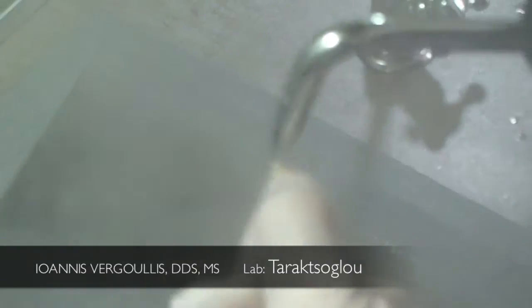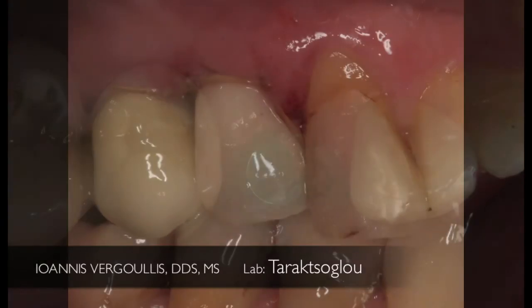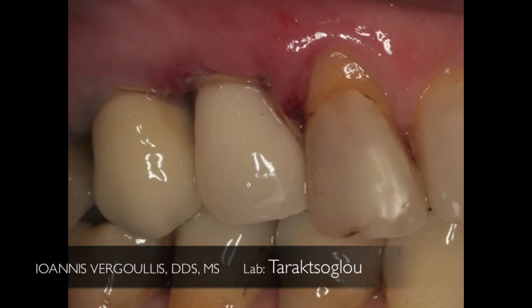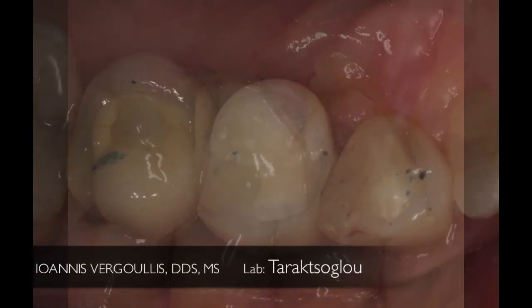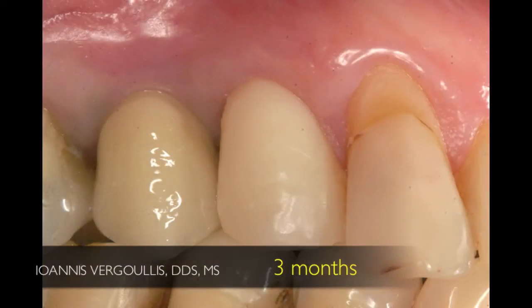The temporary crown is decontaminated utilizing a steamer and then placed into position and screwed at 30 newton centimeters. We evaluate the occlusion and make sure we don't have any contacts during lateral excursions. As you can see, three months later we have very nice soft tissue adaptation around our temporary crown.